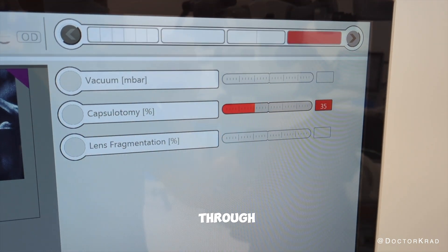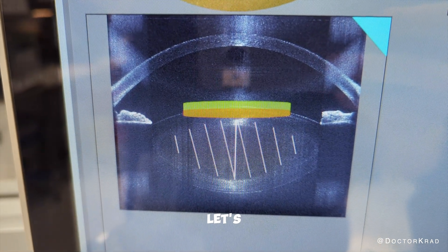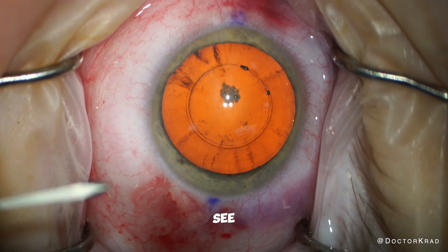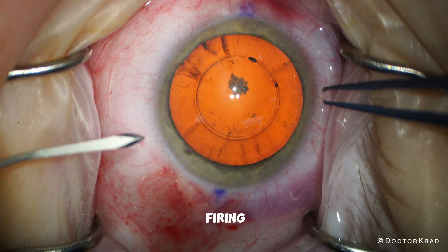35% of the way through the procedure, suction is lost. We can see that the plane in which the laser was firing was right at the anterior capsule. Let's take a look. As you can see, there are no stray shots and the laser immediately stopped firing as it was supposed to.